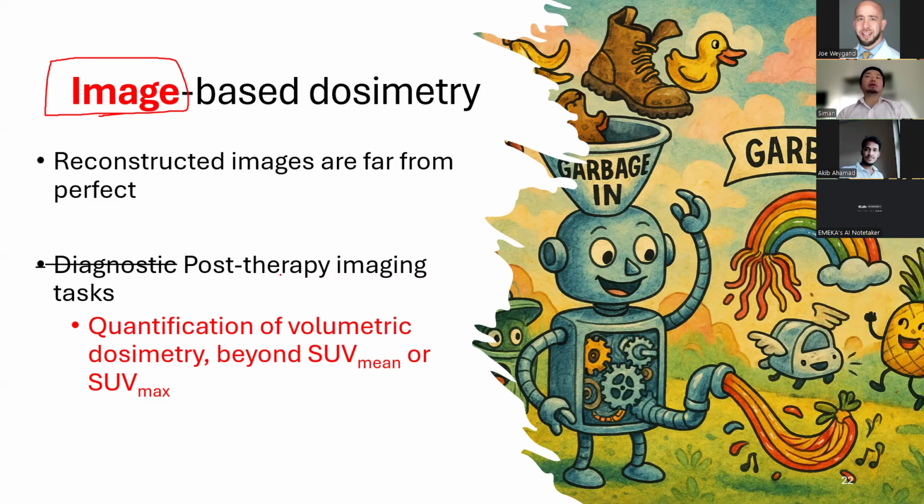Again, in an ideal world, you can recover what your object truly is, and then you do not need objective functions, but that is not the case. In post-therapy imaging, the task is not a diagnostic task, it is a quantification of volumetric dosimetry. So you shouldn't use a diagnostic metric like SUV mean, SUV max, or CNR.